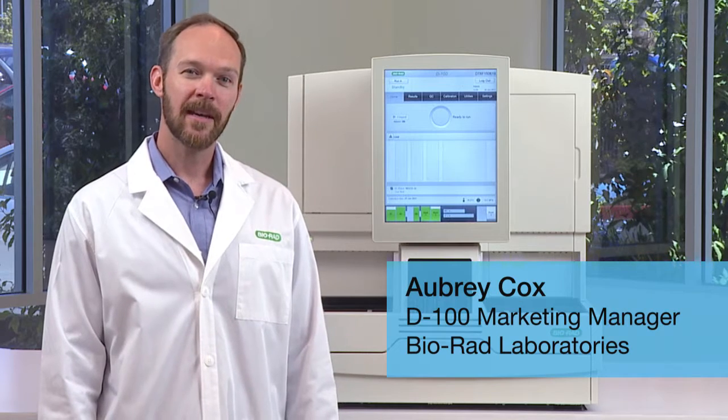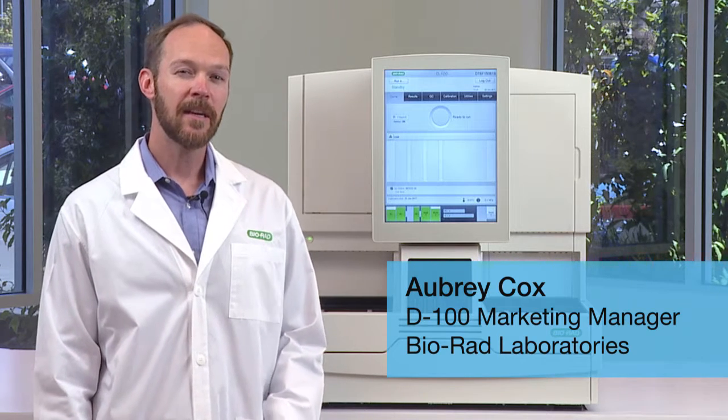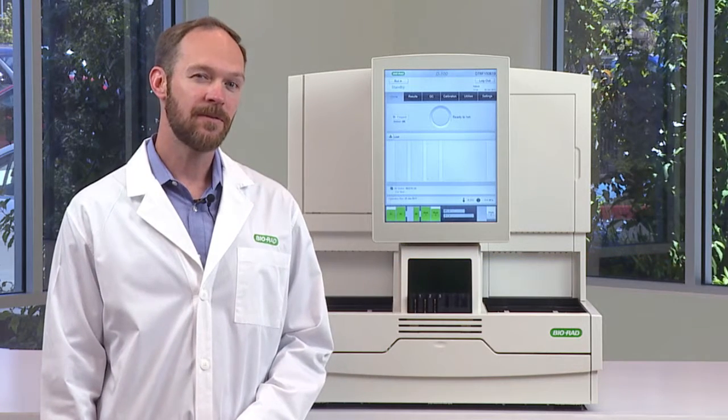Hi, I'm Aubrey from Bio-Rad Laboratories, and I'm here to talk to you about the D100 hemoglobin testing system. I want to show you how you can get more done with the D100's efficient workflow.